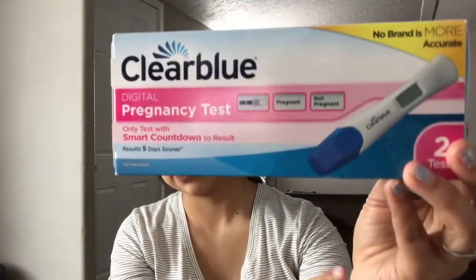So I got frustrated with the pink and blue dye stuff and the false positives and the negatives, and so I sent Saul to Fred Meyer's, and I was just like, get a test, any one. I didn't really care which one, because I wanted to take a test when I got home. And so he got the most expensive test he could find, and it actually says pregnant or not pregnant, so you can't really mistake it. So then I took it and it said not pregnant, and they both said that. When it's a not pregnant, it will just disappear after like 24 hours. But if it says pregnant, then it will stay on there for like 6 months or something.